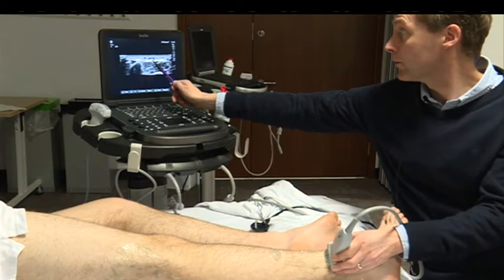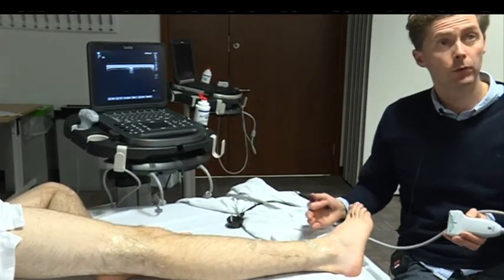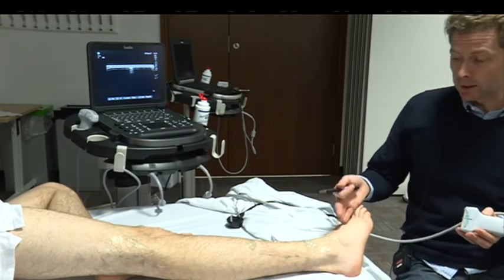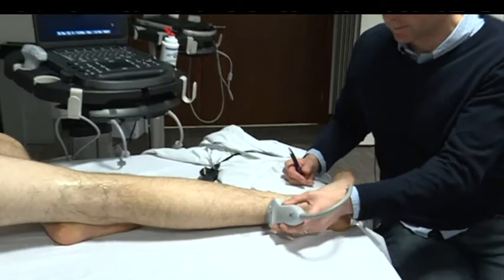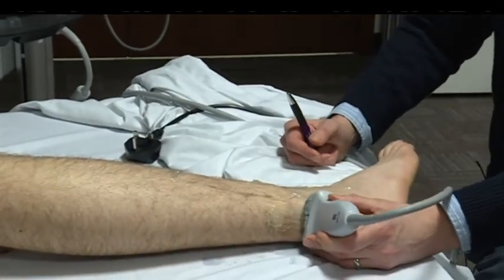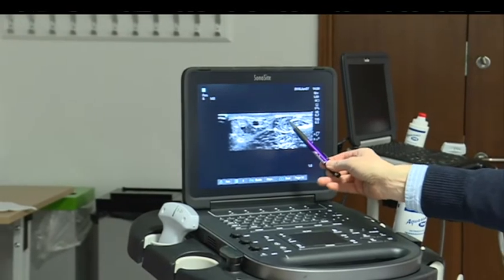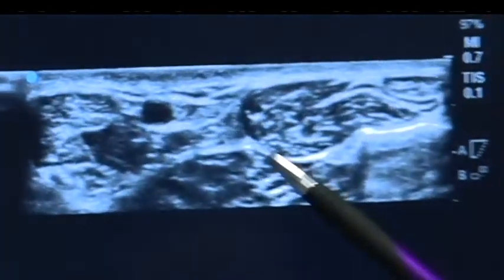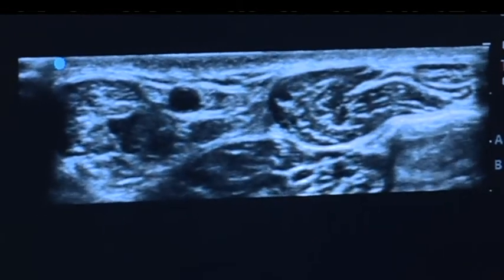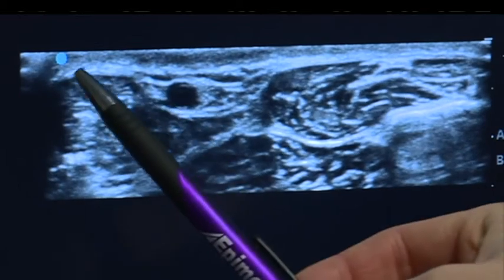The two branches are splitting off there — that's the superficial fibular nerve. For medial forefoot or first metatarsal head surgery, we block tibial, deep fibular, and superficial fibular. For more lateral surgery we also need the sural. Scanning posteriorly again, here's the cycle helmet — peroneus longus and brevis — then the Achilles tendon. Reducing depth, you can see a hypoechoic area — the short saphenous vein — with a small fascial saddle shape between peroneus brevis, the vein, and the Achilles tendon.